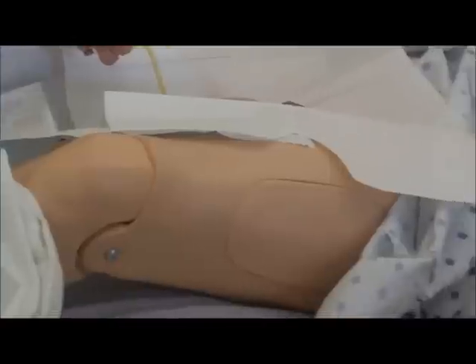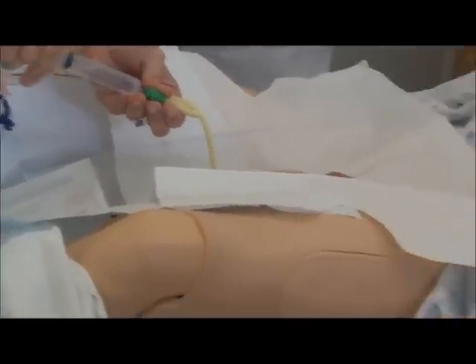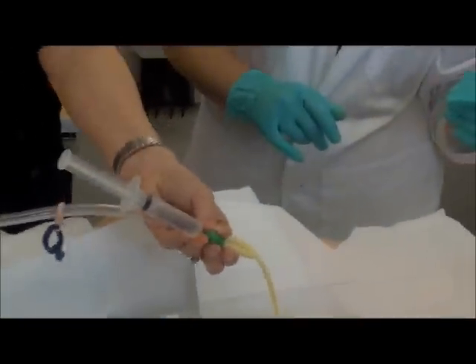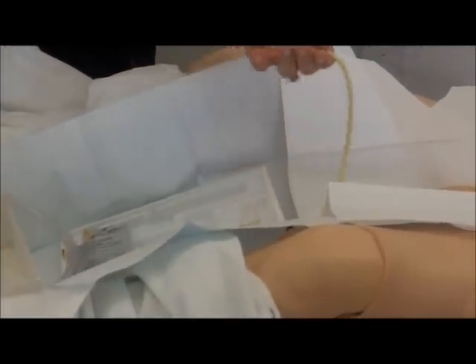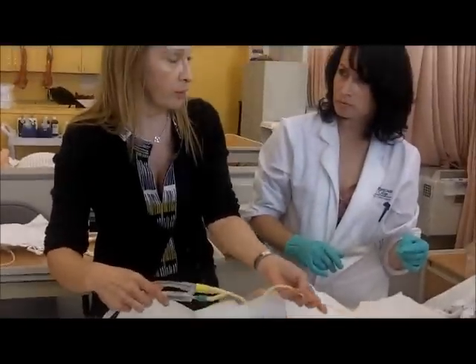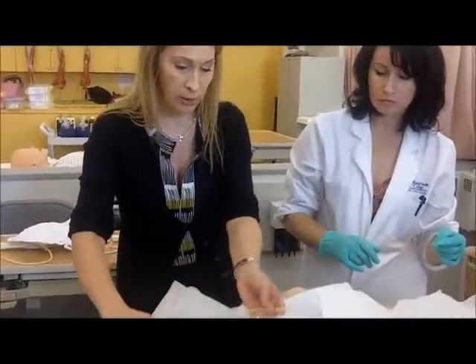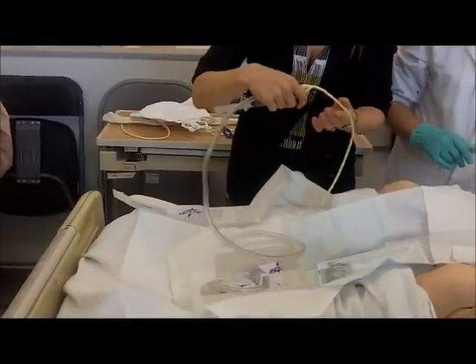So at that point it was okay for you to use your dirty hand to hold it? I'm no longer inserting into it. Because when you're doing pericare, when you're cleaning the urinary meatus, once the catheter is ready, it's the insertion of the catheter into the bladder that needs to be sterile. So when you're originally putting this in, you don't want to contaminate the area that's in the bladder. But when you do pericare in the hospital, you clean the urinary meatus with regular gloves and soap and water. It's just inserting it so that we're not introducing microorganisms into the bladder.